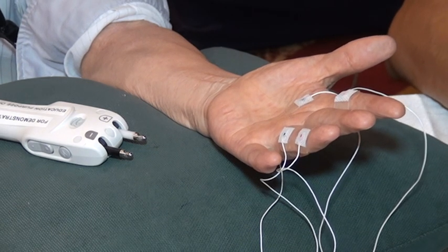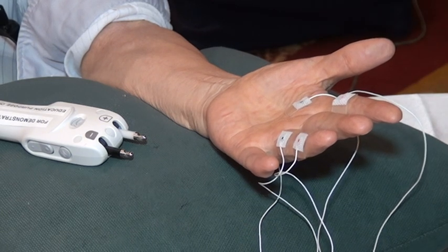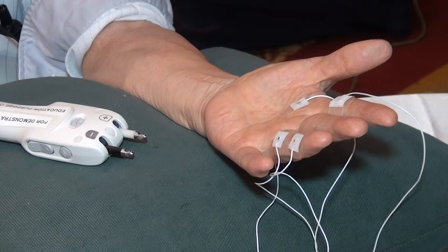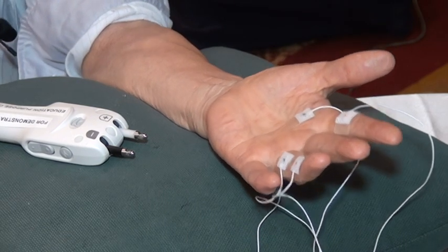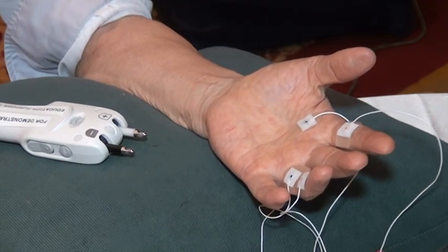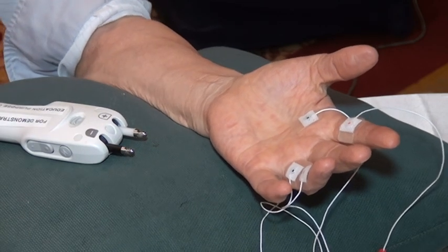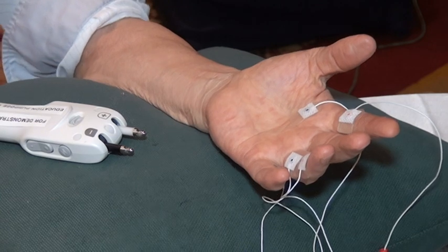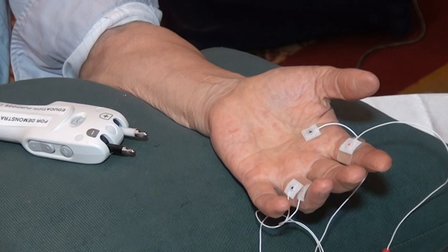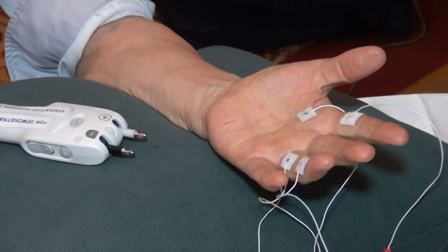And when you inch like that, it should be linear. This marker should move linearly. And it's moving linearly. When you see this, the separation is the same. Are you following me? Okay, let me ask you a question. If you move the cursor, as we did, every 2 centimeters, what is the latency change every time I move? How much? 2 centimeters, as I did.